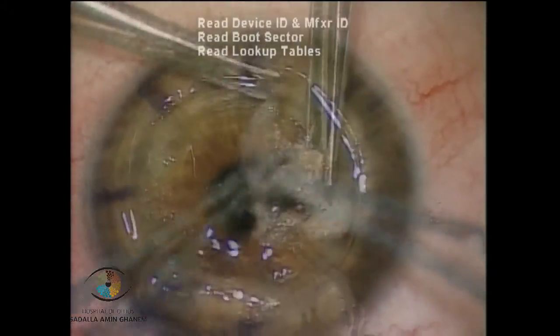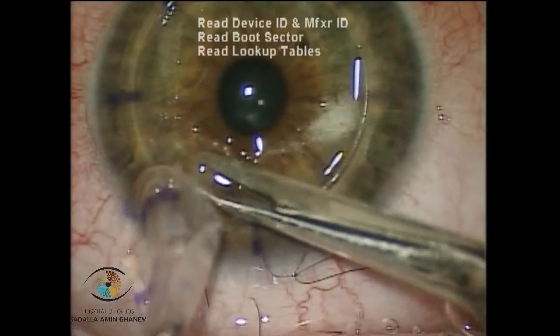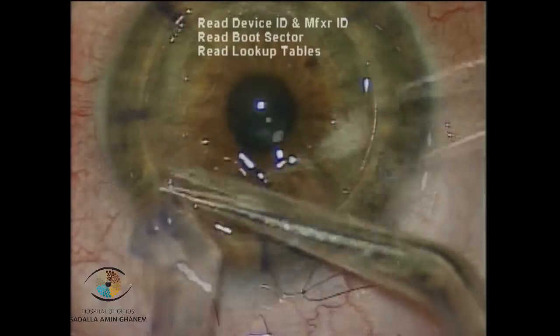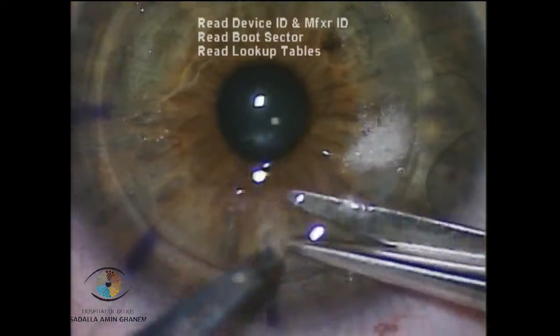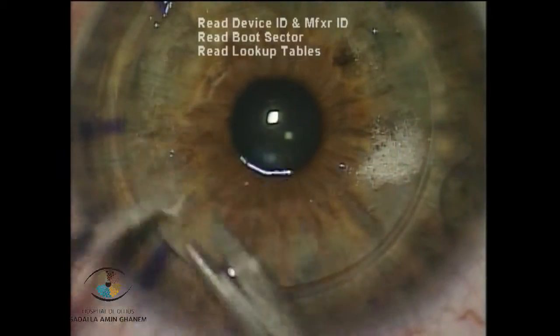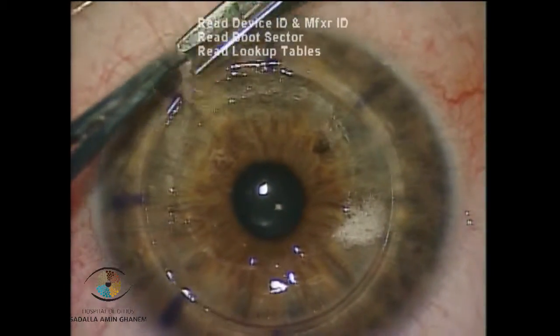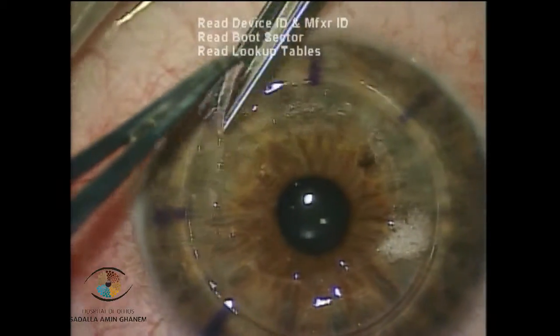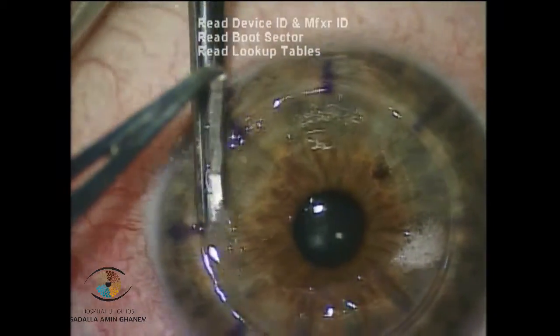Finally, a complete stroma removal is achieved in the central cornea and some stroma is left in the periphery. In this final step I am debulking this peripheral stroma just to leave a thin layer of posterior stroma. In terms of vision, there is no advantage to completely removing the peripheral stroma.